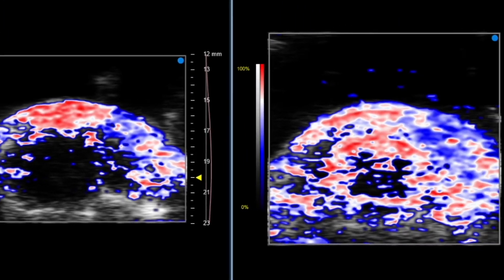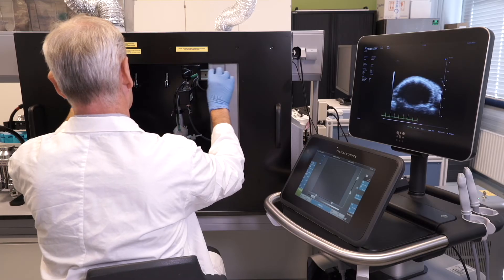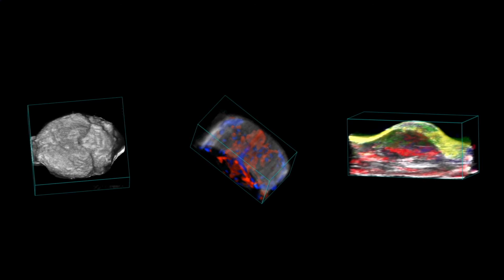Changing to the narrow fiber delivers more light for better sensitivity and a greater observation depth, so you can see just how flexible the platform is. The result is co-registered multimodal imaging with anatomical, physiological, and molecular data, all in one platform.